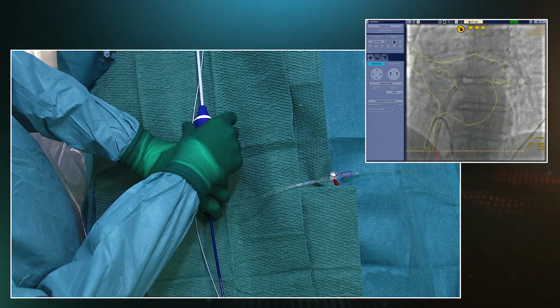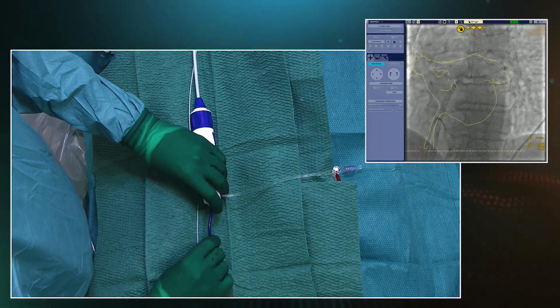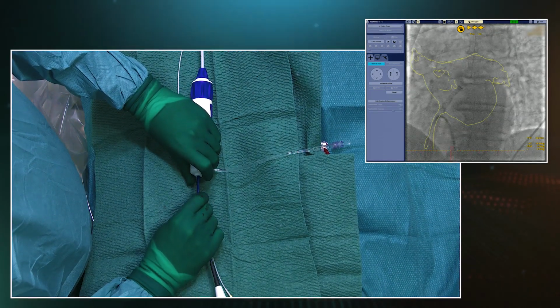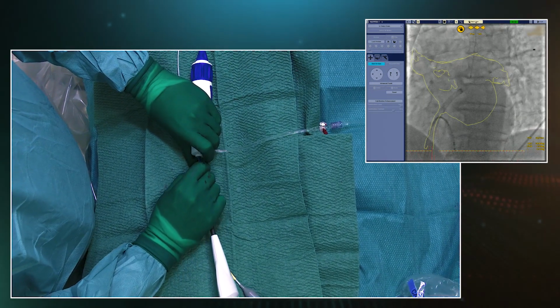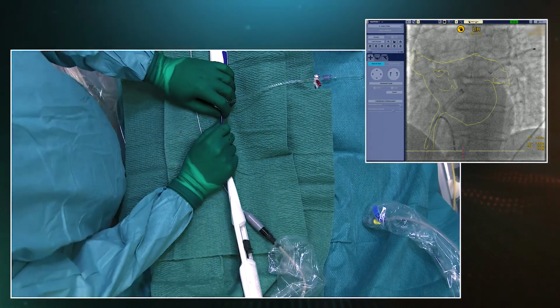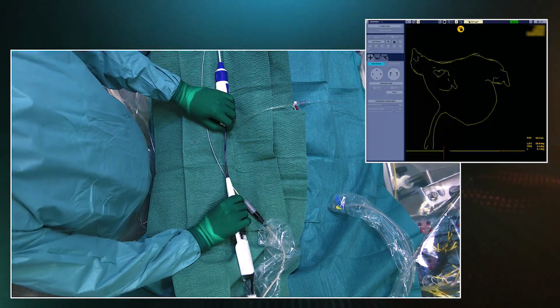And I'm going to deflect a little bit on the sheath, stay clockwise, stay posterior, so that I end up in the vein and not in the appendage, and then let the tip find its way into the vein. Just by gentle push, you see I can deeply go into the vein, confirm that I'm nicely in the vein, do it in a very atraumatic way. The tip is very flexible, very floppy. And now I can pull back a little bit.